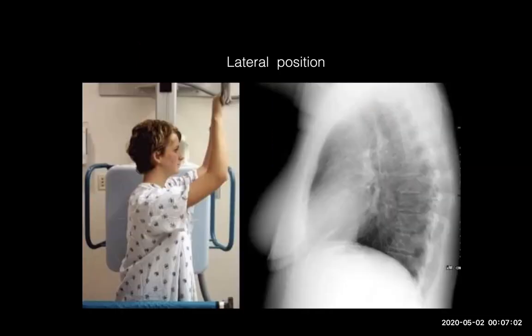Sometimes, for problem-solving or localization of a lesion, we use lateral position — right or left lateral according to the region of interest. In this case, we have left lateral position, and we will obtain a lateral view.